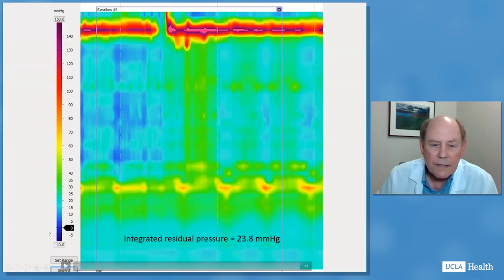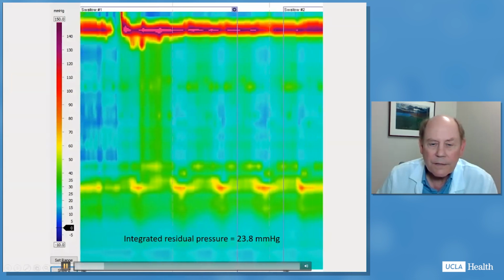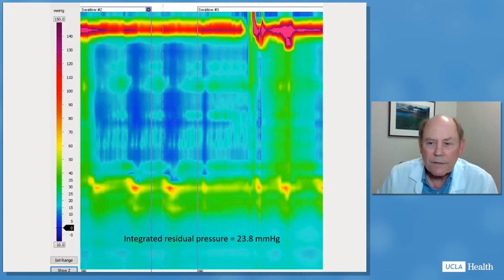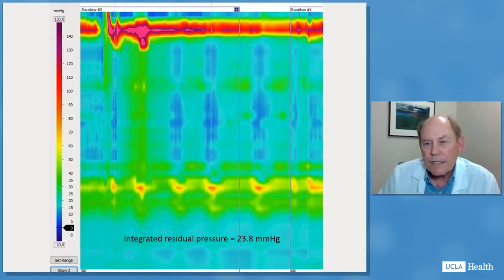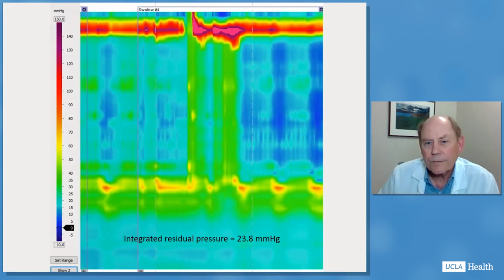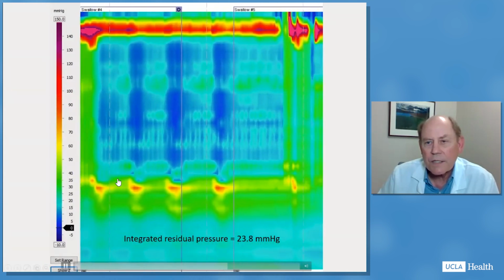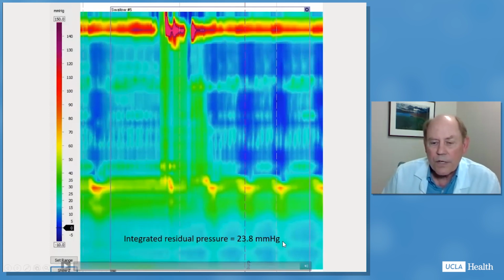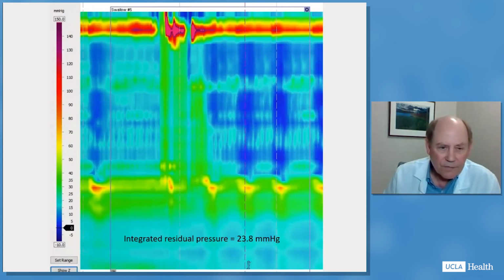And then here is her esophageal manometry. So for all the world, this looks to me like achalasia type 2. There's no peristalsis, simultaneous pressure waves, and the esophagogastric junction is not opening adequately. The integrated residual pressure was 23.8. So now we're here with a little bit of conflicting data. There's some of this that looks like clear achalasia. There's some of it that looks like maybe not, at least anatomically and radiographically, it might not be achalasia.